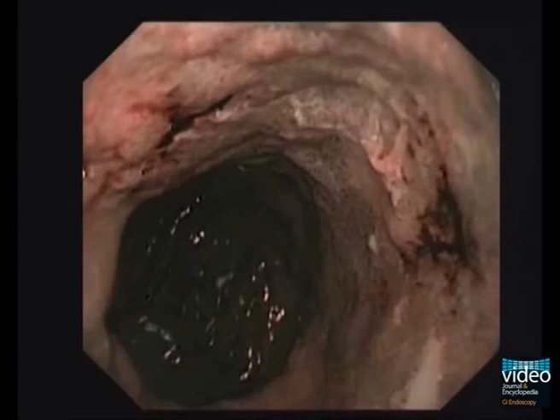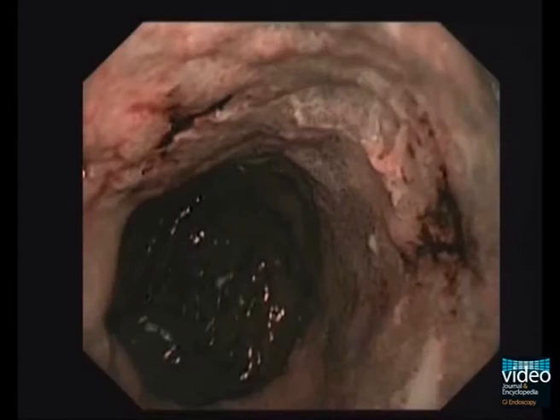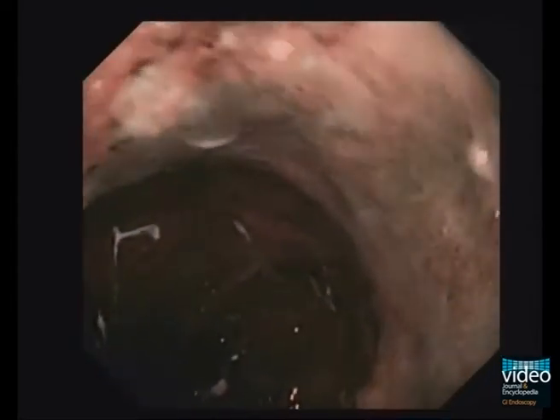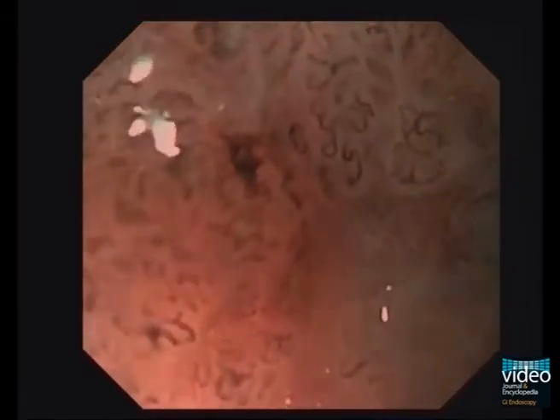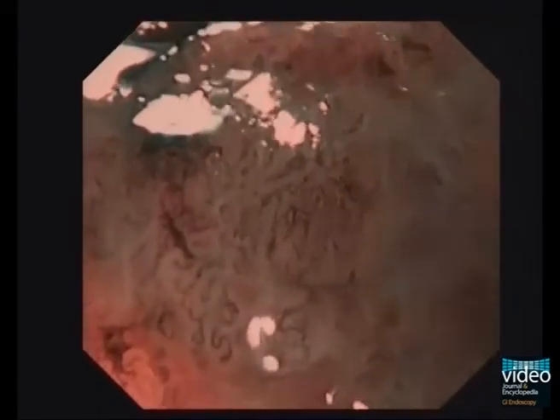Another area distally which appeared irregular on narrowband imaging (NBI) was further assessed with NBI and optical magnification. The vasculature was irregular and tortuous, raising suspicion of an underlying dysplastic area. The pit pattern too appeared grossly abnormal and irregular.